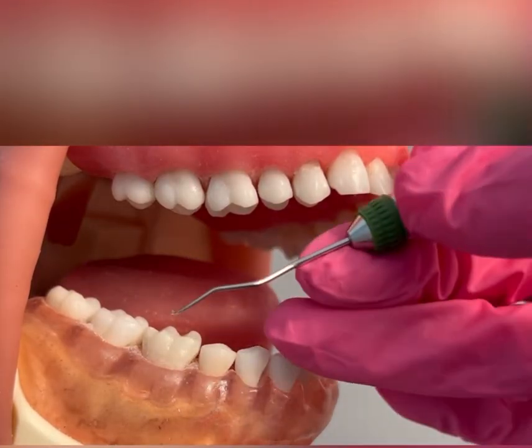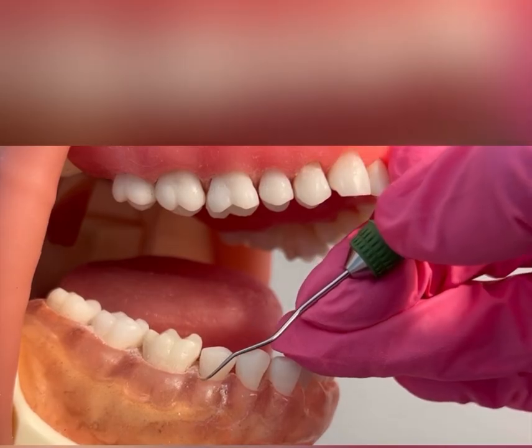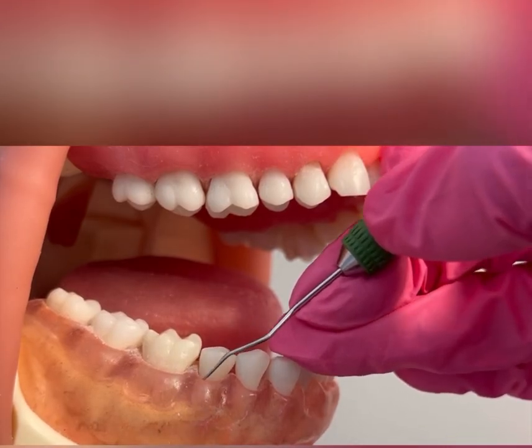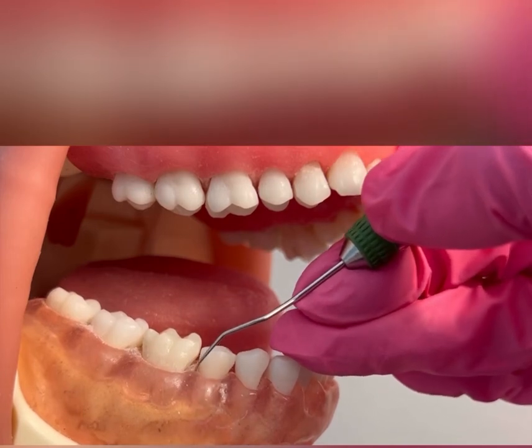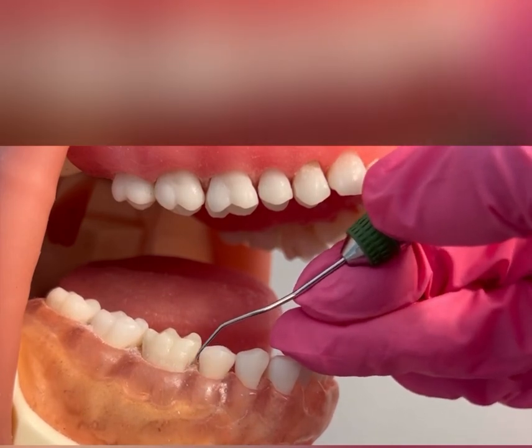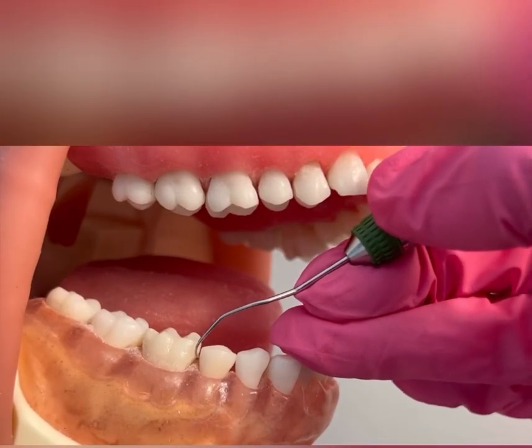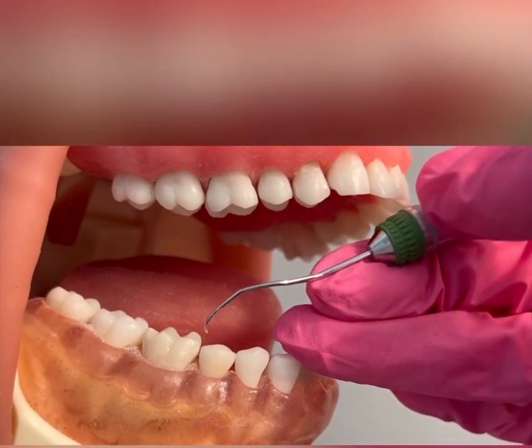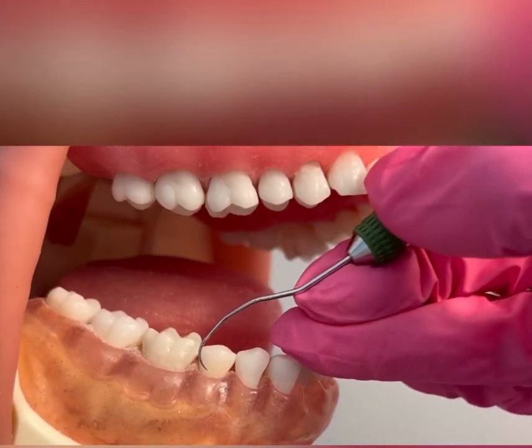I will now demonstrate on tooth number 29, using that same working end. Adapt right at that distal buccal line angle, go subgingivally, overlap with vertical strokes, working my way 51% into that distal interproximal. Come out completely, quarter turn, and now coming into the mesial.